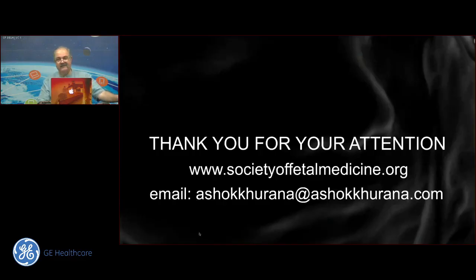We already have the first of our questions coming in, and it says, sir, just like turning off harmonics can be useful to diagnose echogenic bowel, as you said, to differentiate the echogenic kidney. Yes, absolutely. You must always check the echogenic kidney by turning off harmonics, particularly when you're younger. Later on, of course, you learn to recognize it because you get so used to the image. So you get used to what we call pattern recognition or intensity recognition.